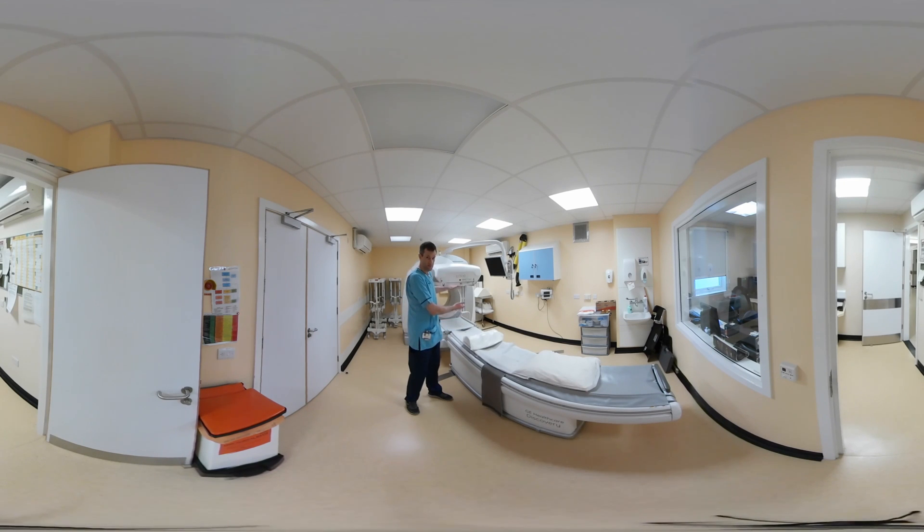The detectors will come down rather close for the scan, but they have infrared sensors in the front, so they can tell where you are and they will not touch you. The scans themselves should last about 20 to 30 minutes.